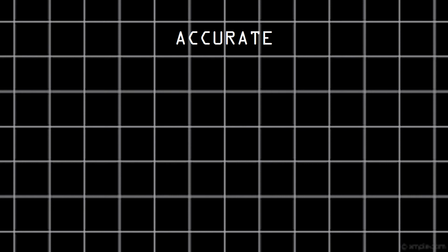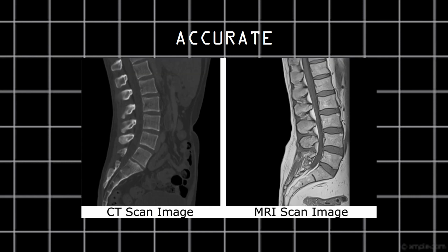Look at this comparison between a CT scan, which uses X-rays, and an MRI. The shape of the tissue and bone of the spine is more clearly defined in the MRI scan. This allows radiologists to examine the images more clearly and provide an accurate diagnosis. MRIs are also able to scan large portions of the patient's body and produce slices of cross-sectional images at every angle, which again allows radiologists to perform deeper analysis of the patient's body.